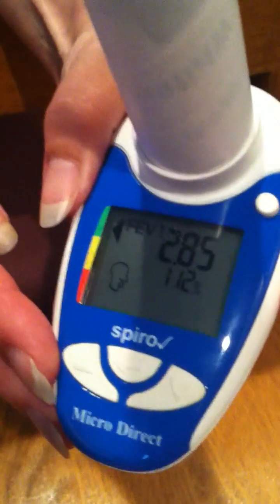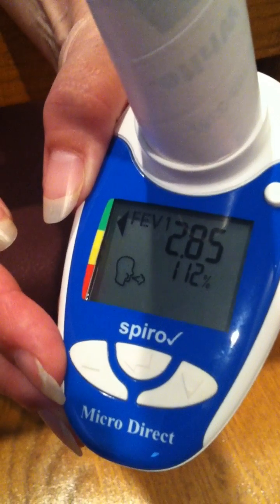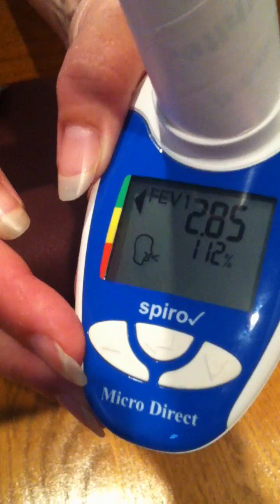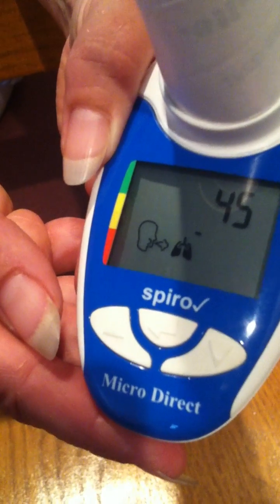Now we are ready to review the test results. The first number you see is the forced expiratory volume at 1 second, FEV1, along with your percent predicted. Press the up arrow key to display the estimated lung age.